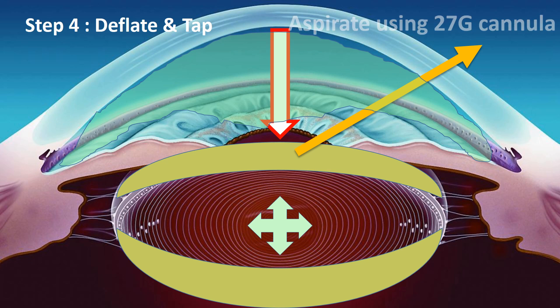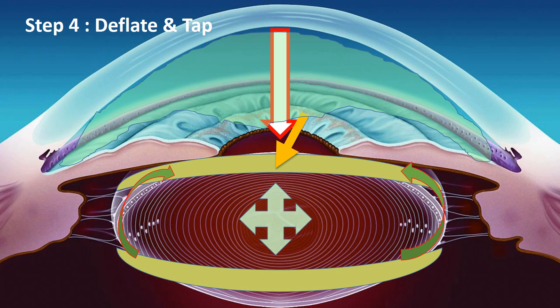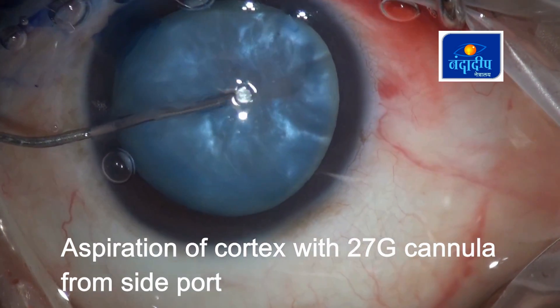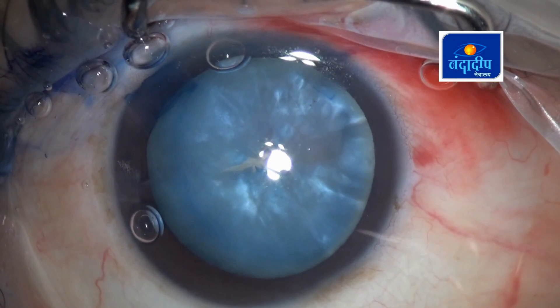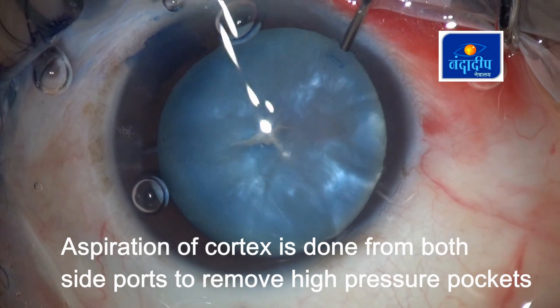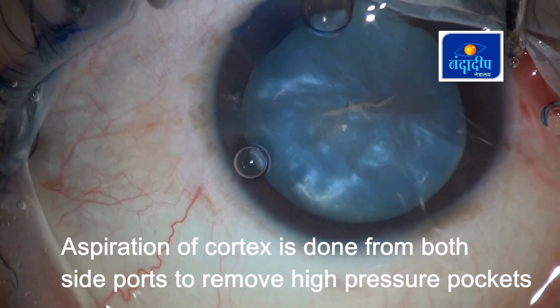Step 4: Deflate and tap. We use a 27-gauge cannula to aspirate out the anterior cortex, then tap the nucleus down so that the fluid trapped between the nucleus, cortex, and posterior capsule comes out into the anterior part. These maneuvers help bring the intralenticular pressure down. We use the 27-gauge cannula from the small side port to take out the mid-peripheral cortex while also tapping the nucleus down. Once some cortex is out, we re-inflate the anterior chamber and go from the other side port to take out cortex from the other part of the lens — otherwise, intumescence may remain on that side and cause radial extension.